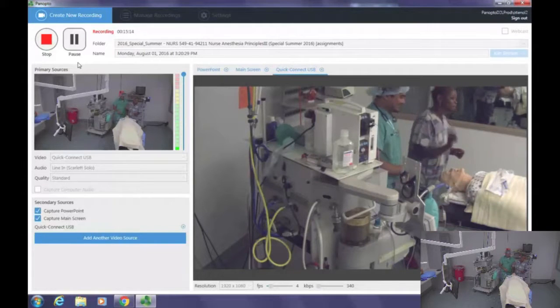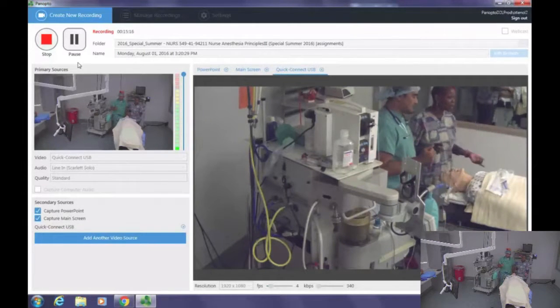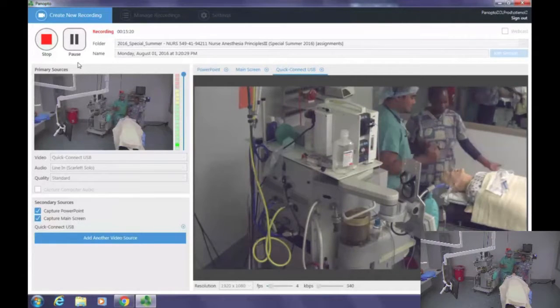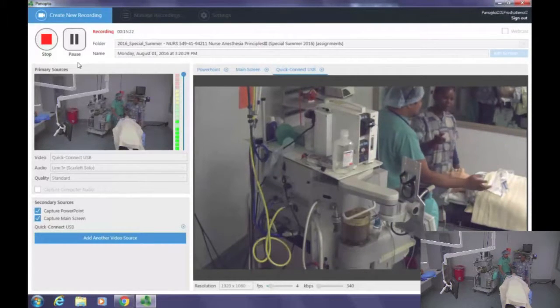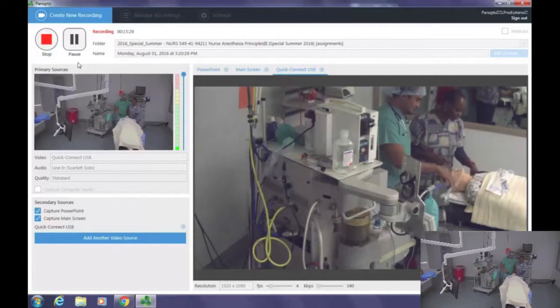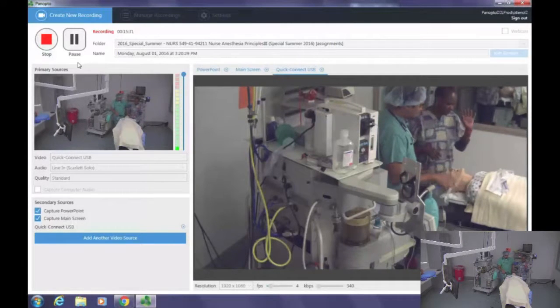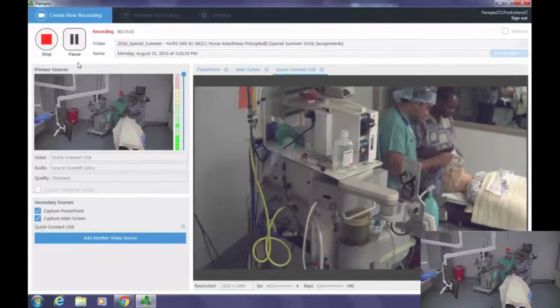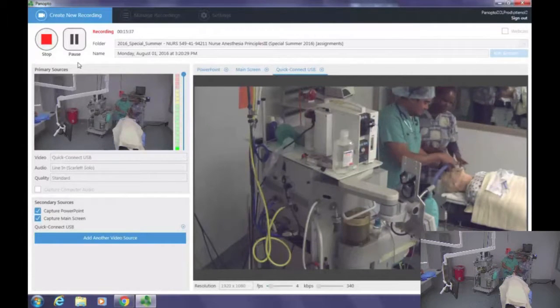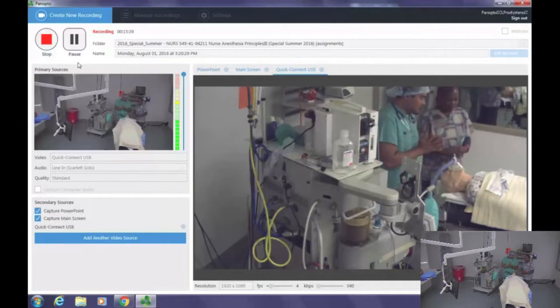I'm going to put the pulse oximeter on the hand with the IV, and then we'll place the blood pressure cuff on the other arm, and then cycle the blood pressure. Then we put in the monitors, and then we're going to pre-oxygenate the patient with 100% oxygen. So now we're oxygenating the patient.